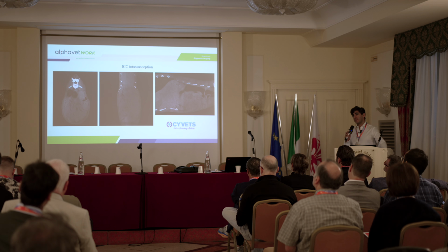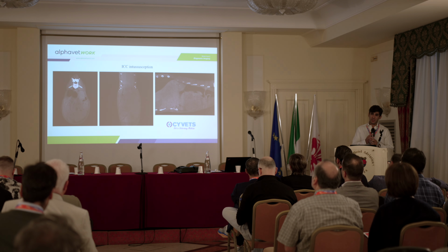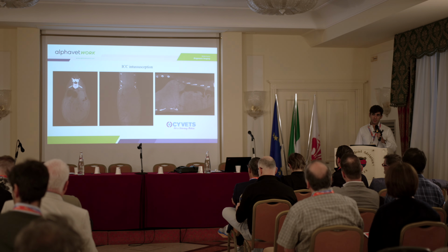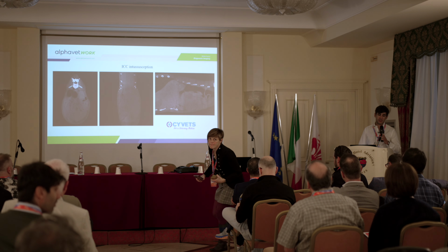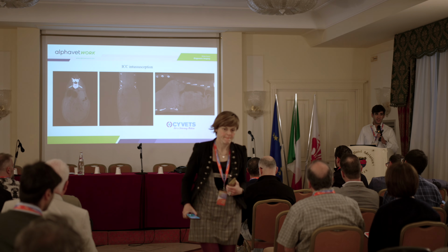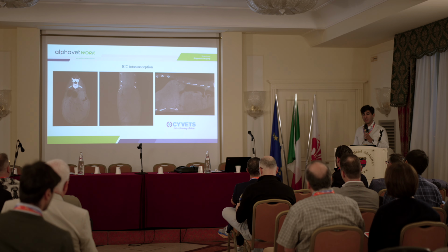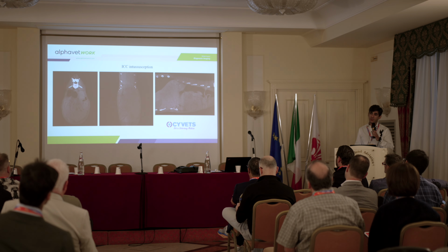And I'm not showing only the good images, I'm showing also the bad images. This is a study that was done late at night in Cyprus. There was a vet that was not familiar with the machine. The patient was not stable. And he sent me this CT scan without contrast medium. And I could depict that it was an ileocolic intussusception, and I sent it immediately to surgery. So, it could be a tool for emergency cases.